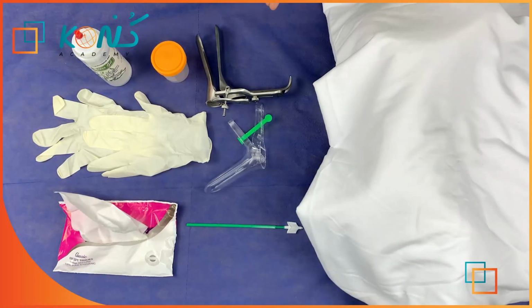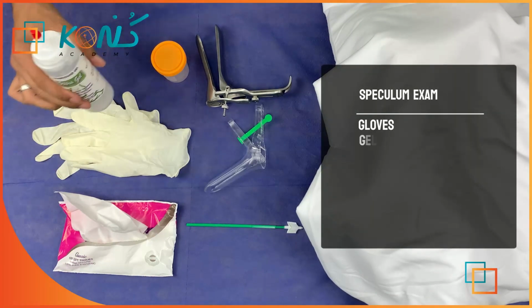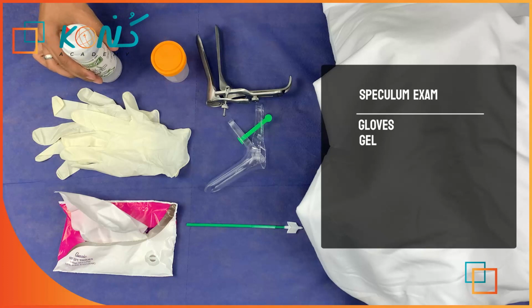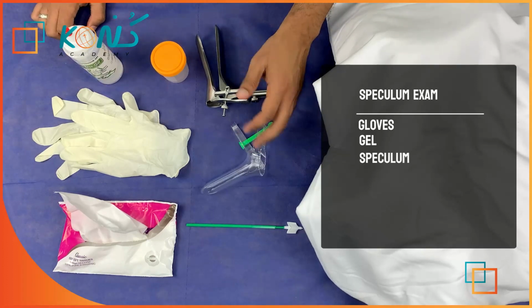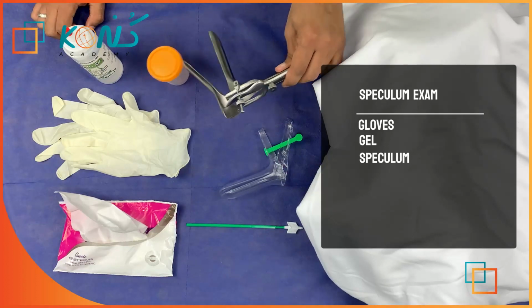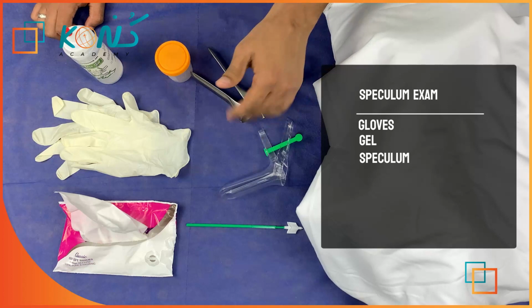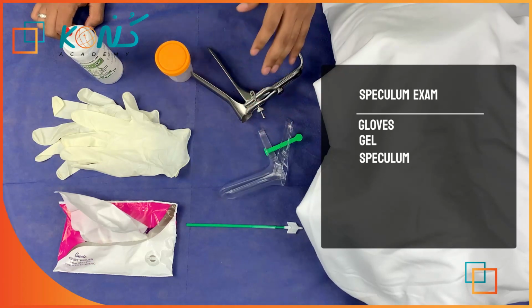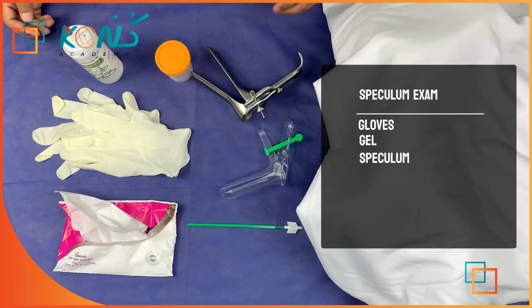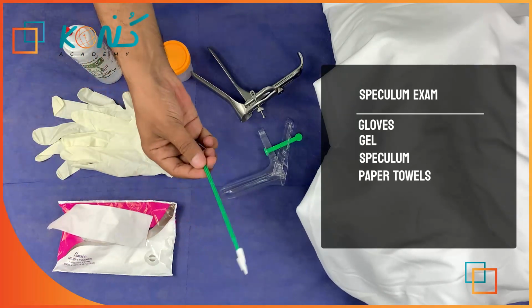Regarding the tools for speculum examination and cervical smear, you will need gloves, gel, and the speculum. We have two types: a disposable plastic one and a metal non-disposable one. You can have either one of these in your exam, and you also need paper towels.